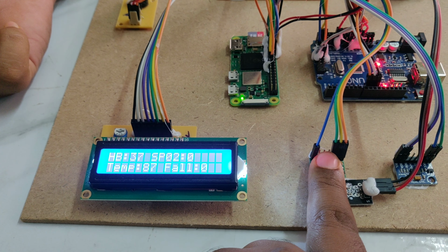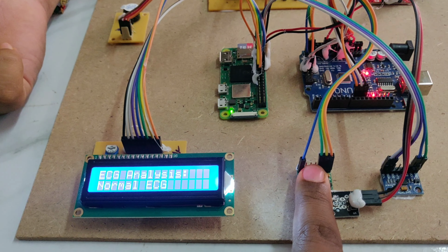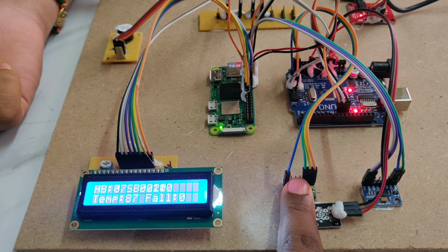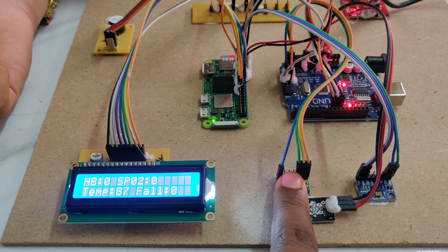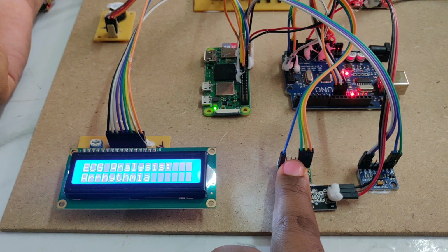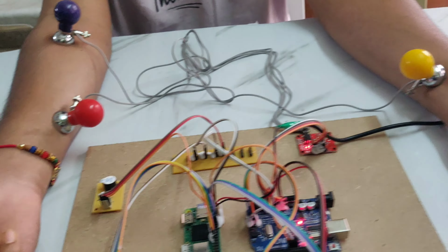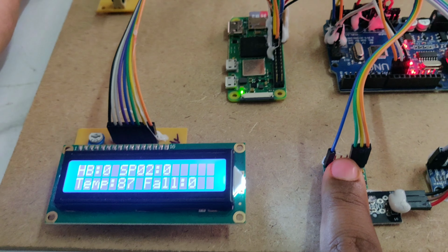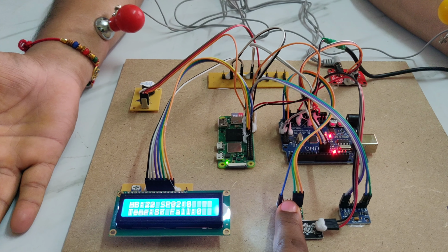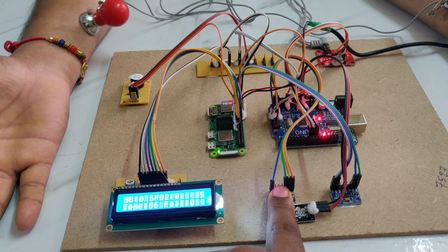There we are detecting arrhythmia, and we are just changing the position. Right now it's a normal ECG. In this case, this is just showing the output stages of a normal ECG, and when we place the finger on this one, it's arrhythmia detection. If we move the hands at the electrode section, then we get an abnormal ECG, which leads to the detection of a disease.